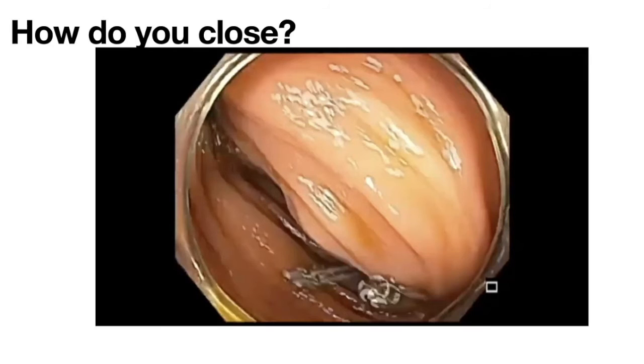Yeah, I'm glad that you brought it up. I think the next step is for this patient to see Selvi, for her to do the genetic studies, and also the next time we could consider that. I have to share this with you, and I wanted your input on this. I do spend a lot of time examining the colon, probably one of the slowest in my group, if not the slowest. As a principle, what I've learned from Roy is I use a very circular motion and try to look at the wall with my cap almost touching the wall.